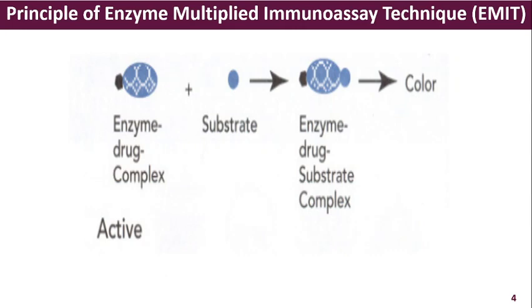Now, using this principle of the production of color by the enzyme substrate reaction, we move on further to how the enzyme multiplied immunotechnique is carried out.